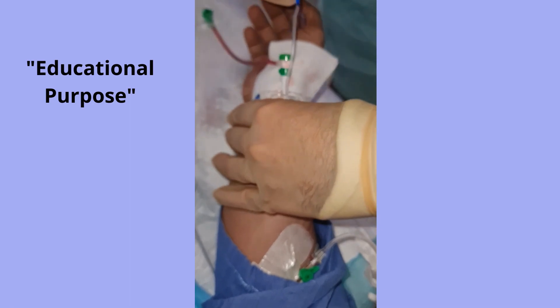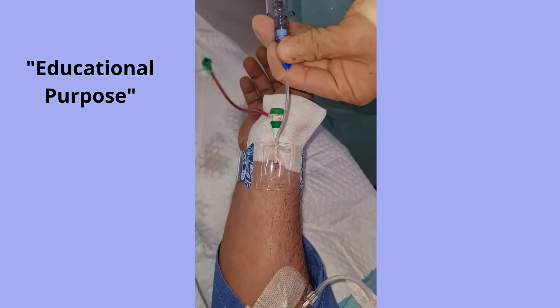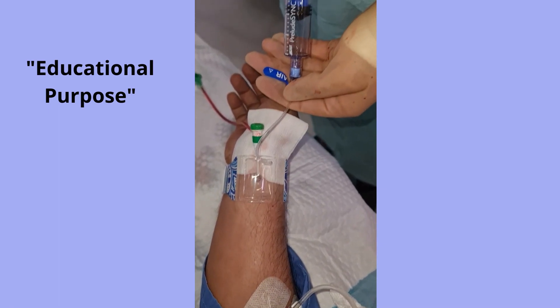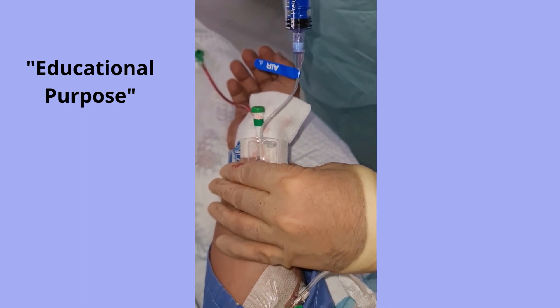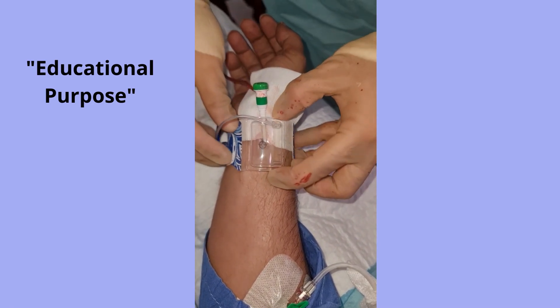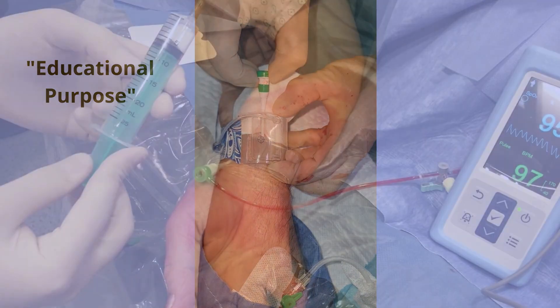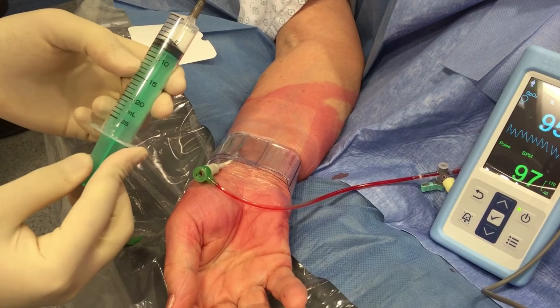Slowly inject 15 to 18 ml of air while removing the sheath. Air should be fully inserted when the sheath is completely removed. Then slowly withdraw air back out via the syringe, one cc at a time, until the operator observes blood leaking out from the puncture site. Confirm radial pulse and evaluate radial artery patency.